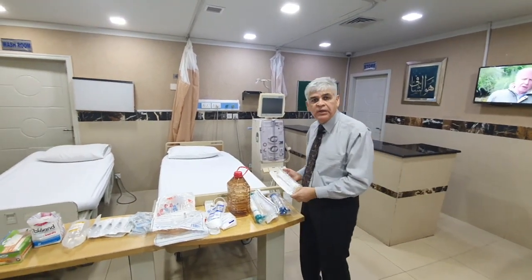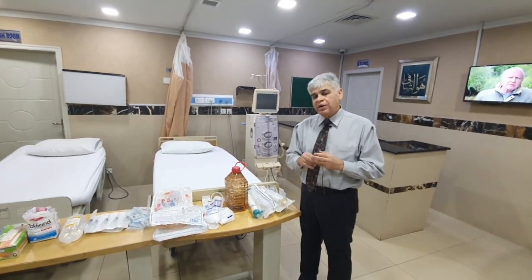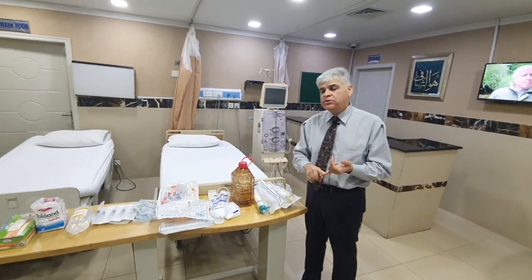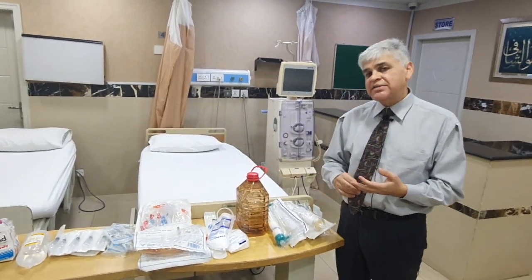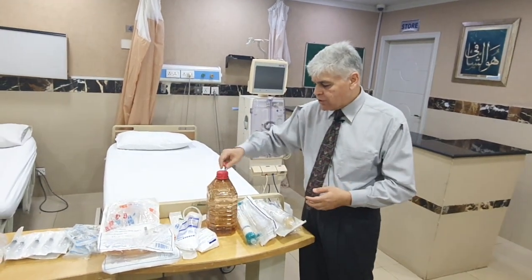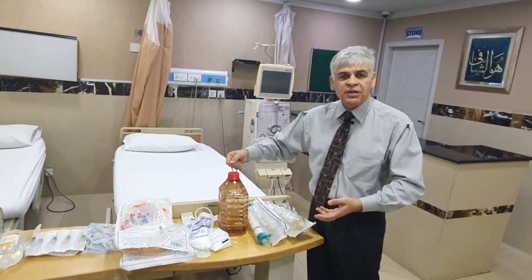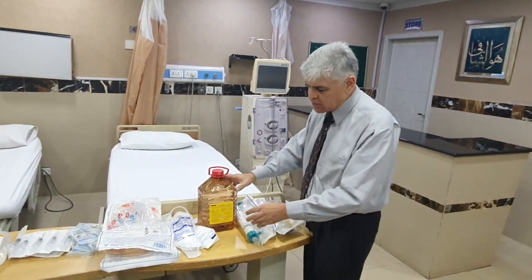So before you start treatment for every patient, remember, as I said, it's a custom-fit procedure. One size doesn't fit all. Please make sure that your needles are appropriate for what you want to use in that particular patient. If you want phosphate clearance, you can get phosphate clearance by using a bigger size dialyzer. If you just want to clear the potassium, you can clear that with a smaller dialyzer as well as an ordinary needle. But if somebody is chronically hyperkalemic, you would want to make sure that the potassium bath is low. Although studies have shown that it probably doesn't really make a difference whether you use a low potassium dialysate or a normal potassium dialysate. Potassium is something totally different.